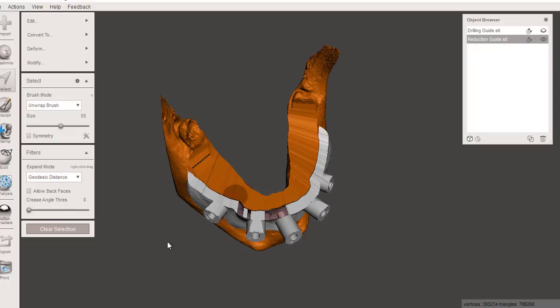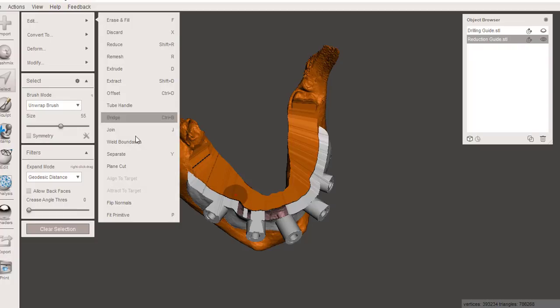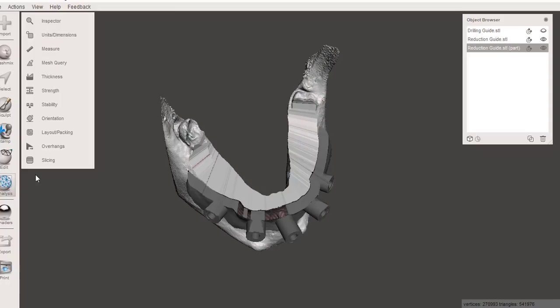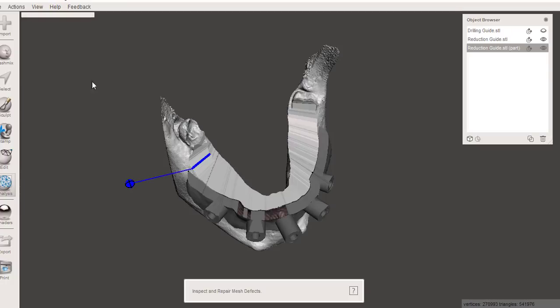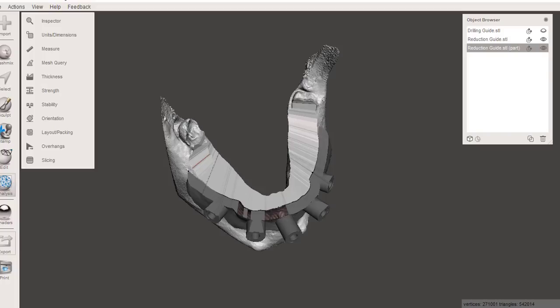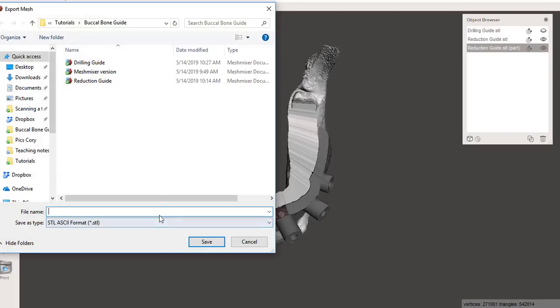So if I select it all, I can come up here and hit Separate, and you're going to see it turns it into its own STL now. It's pulled that apart from the reduction guide. So let's repair that jaw because it's got some mesh cut failures here. Inspector, we can fix that. And now that's done, and you could save this as your reduced jaw.